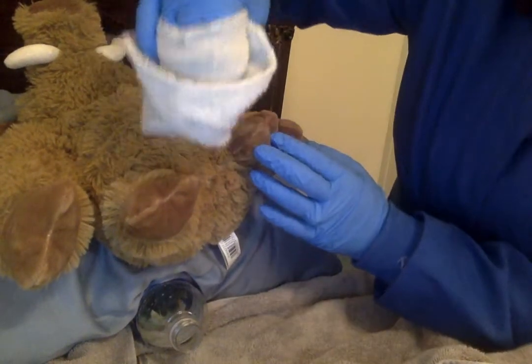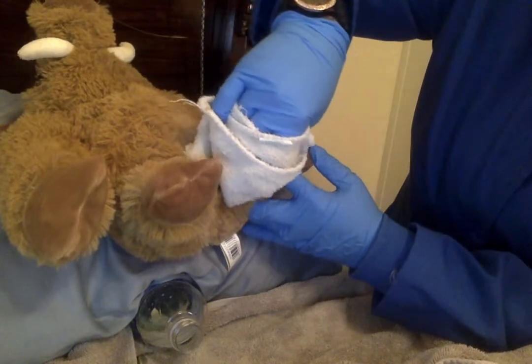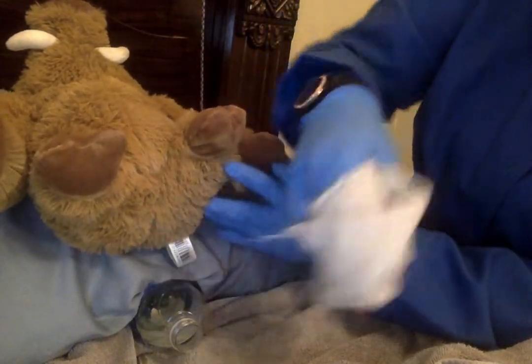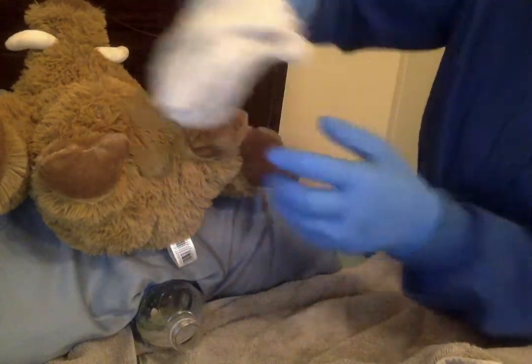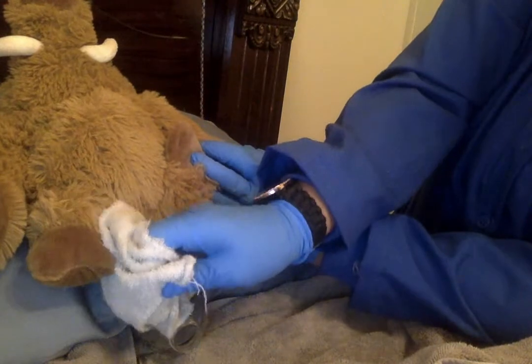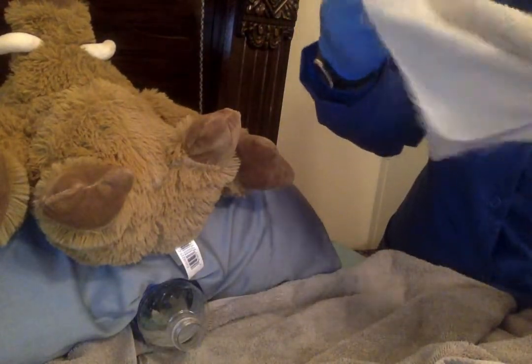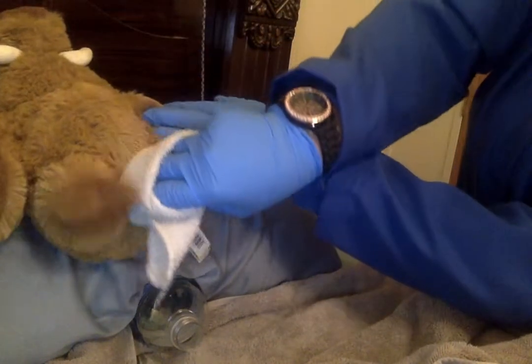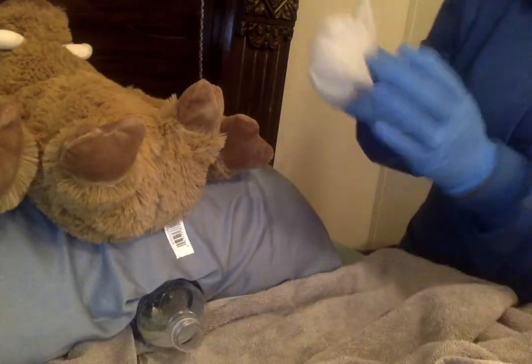We're going to start from this side and go down towards the anus. And then we're going to switch sides of the rag and do the other side. And then we're going to switch sides of the towel again, and go straight down the middle to the bum.